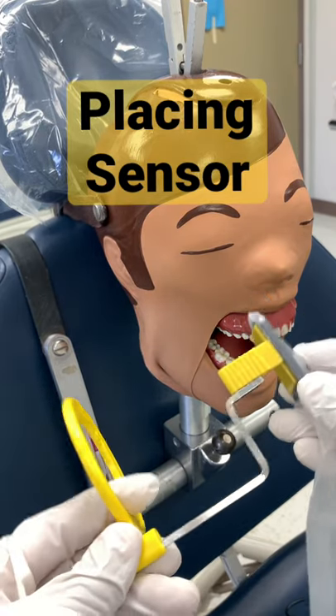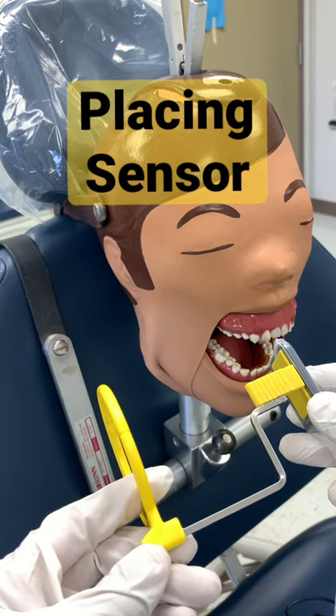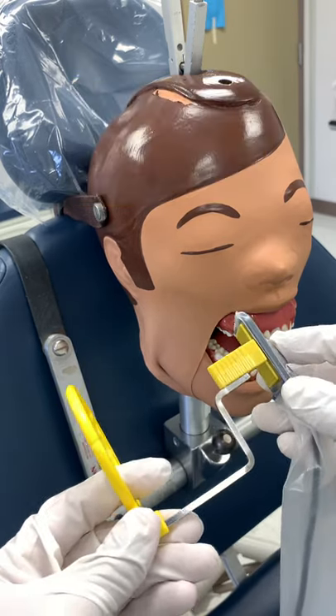All right, so let's talk about getting your x-ray — your radiograph holding device, your paralleling device — into the patient's mouth for, say, tooth number 4-6. So we're going to prep to do that.